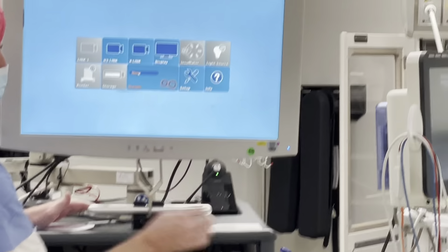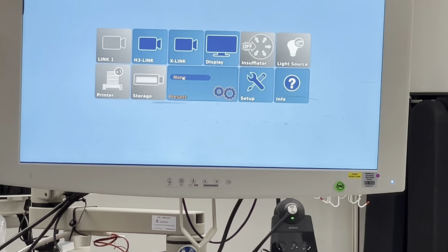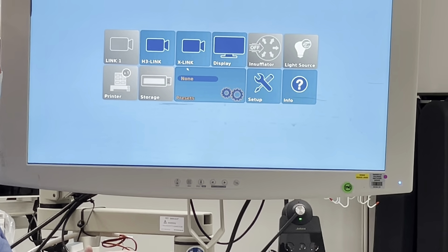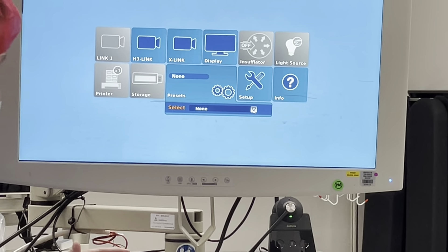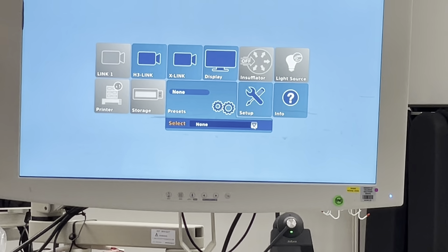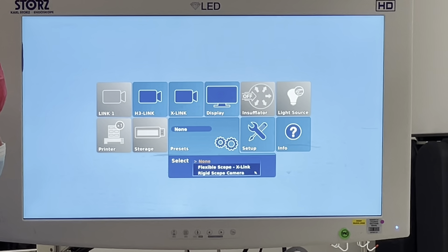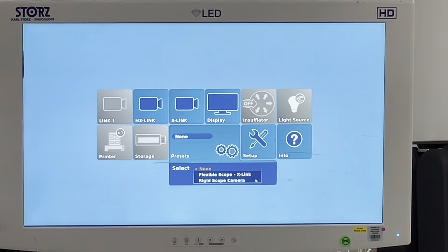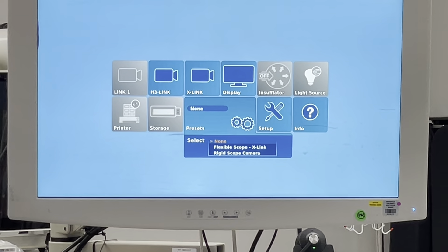What I've done is set up presets. When you turn this on and nothing is plugged in, you'll see these tiles. If you know you're going to use a flexible scope, you just need to come to the presets — there's a keyboard here, and I'm actually using a little mouse pad with left and right click buttons. You have three options: if it's set on 'none,' it defaults to the rigid camera head. The second option is flexible scope x-link, which is our neuro scope — that's what we want.